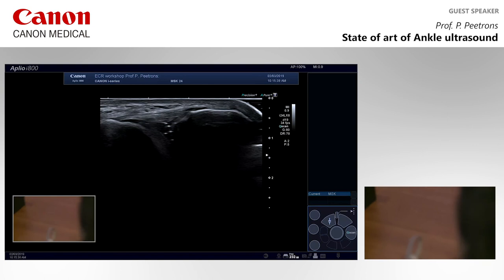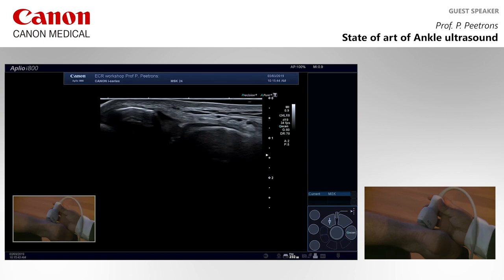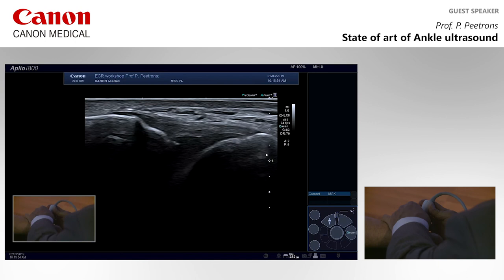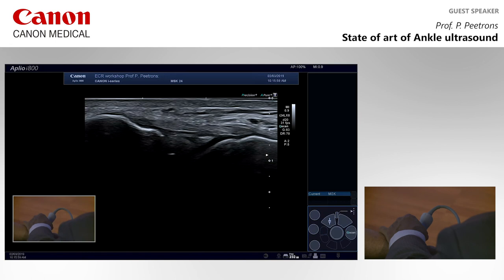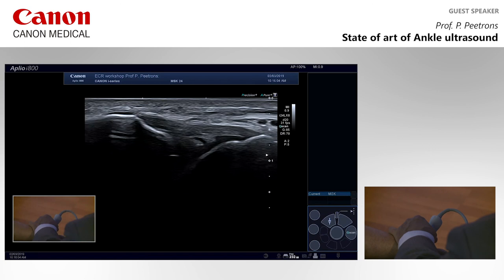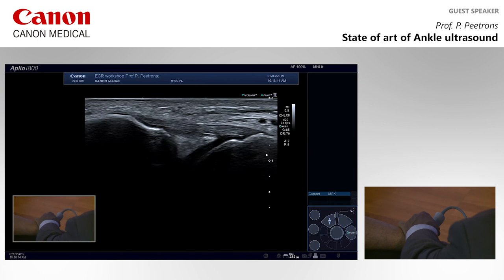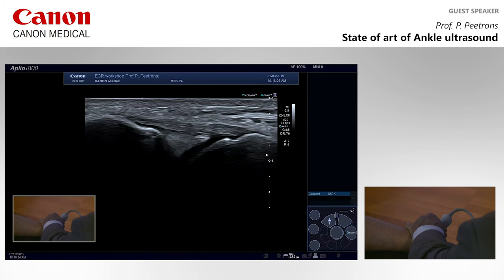You can see on the left now the fibula, and on the right the talus, and you can see the ATFL in the middle. Like this, perfect. So I hold the probe with my left hand, and I pull down the foot, and you see that there is absolutely no movement between the two bones. There is a movement in the joint, of course, at the deep level of the ATFL. You can see the fatty tissue of the joint moving between the tibia, the fibula, and the talus. But there is no movement of the talus itself compared with the fibula.